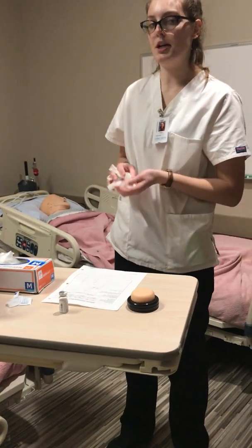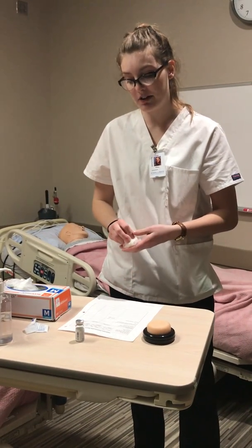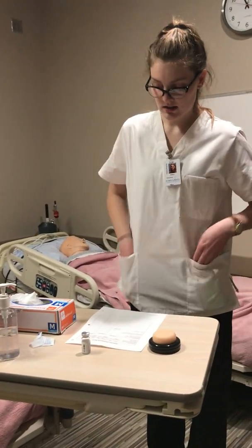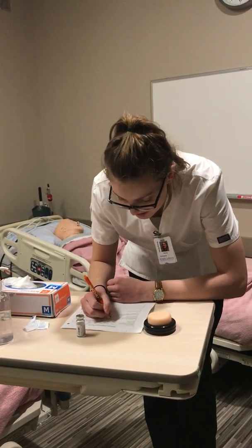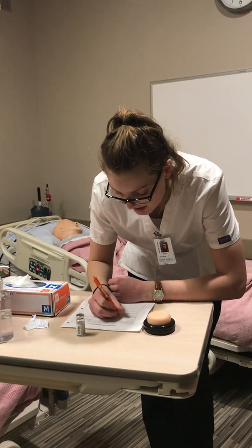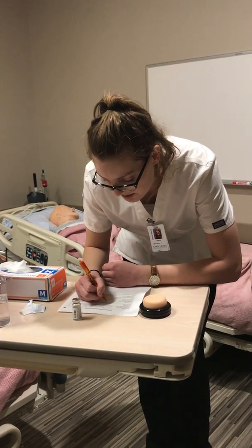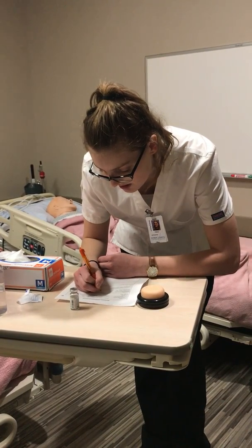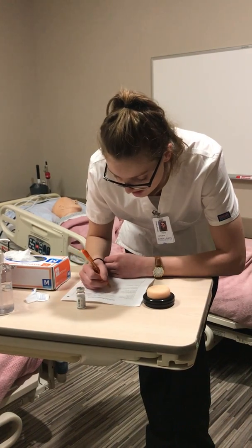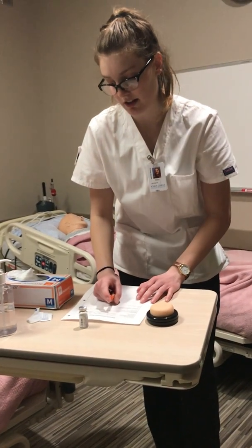If I had a Sharpie, I would go to the patient and mark where I inserted it so it will be able to be read between 48 and 72 hours from now. So I'll throw in my gloves. And with my pen, I will write down the time that I took the test. And on here it says to write down the time it may be read in between those time frames. I'm going to write the amount, where it was injected. So I would write the mid portion of the forearm, and I would then initial it and also sign it and make sure all the documenting information is on there.